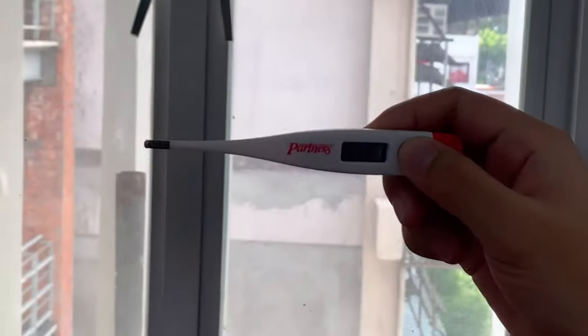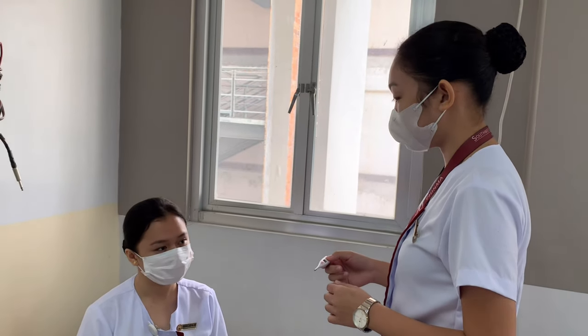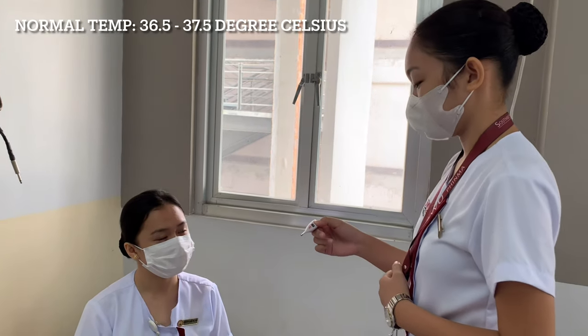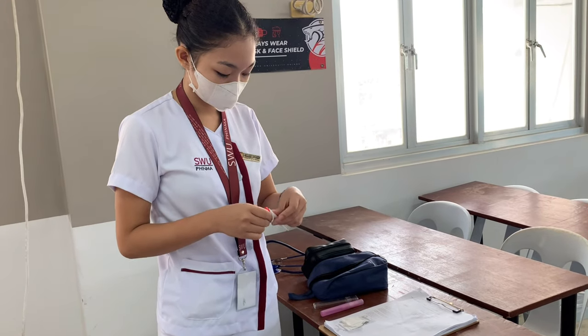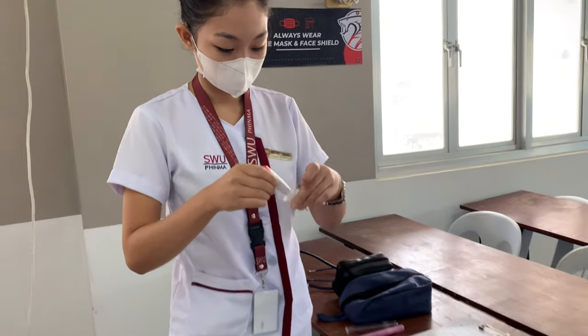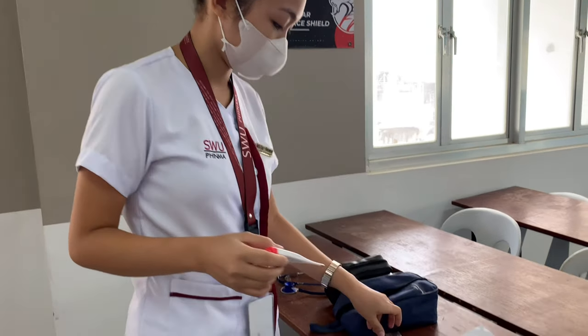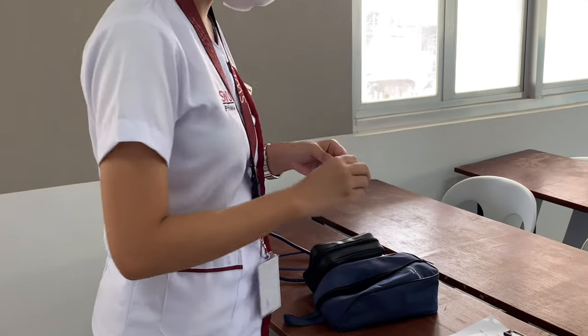Remove the thermometer when it beeps and read the digital display. This allows accurate temperature reading. Inform your patient about his or her body temperature. Cleanse the thermometer using alcohol swabs before placing it back — this prevents the transmission of pathogens or microorganisms. Place the thermometer back in its holder and keep it securely until its next use.